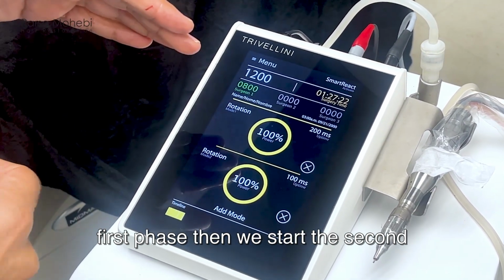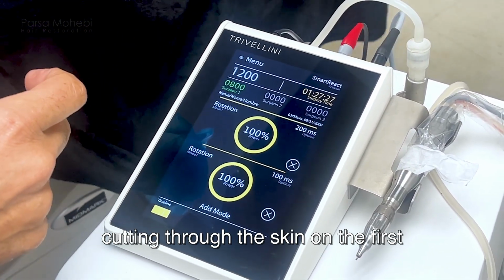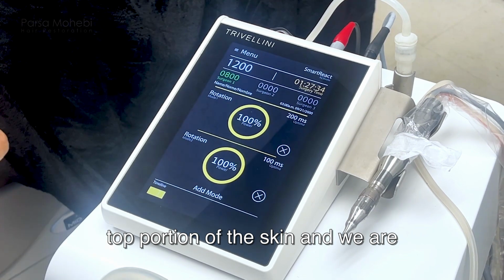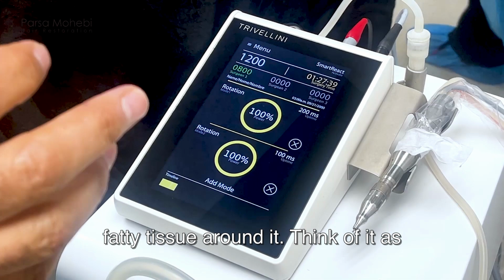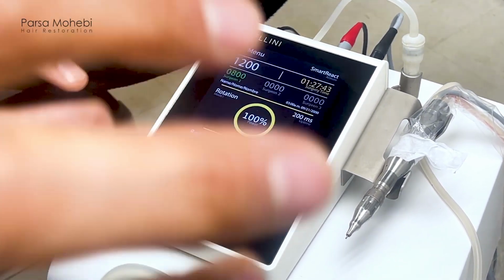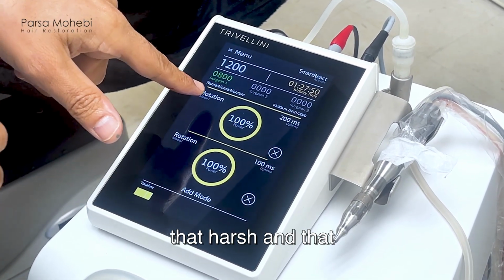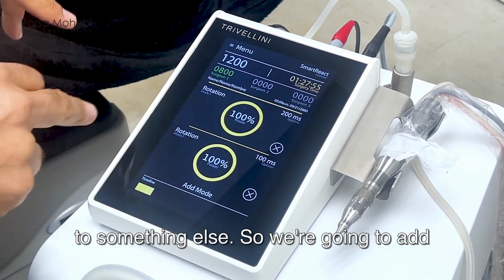So when we cut through in the first phase, then we start the second phase. At this point, we are done cutting through the skin in the first phase, and we're ready to move on to the next level, meaning we've cut the top portion of the skin and we are waiting to liberate the grafts from the fatty tissue around them. Think of it as the hair follicles floating in a pool of fat. They just need to be liberated enough, just loose connections need to be cut. So we don't have to go that harsh and that strong with the rotation. So we switch it to something else.